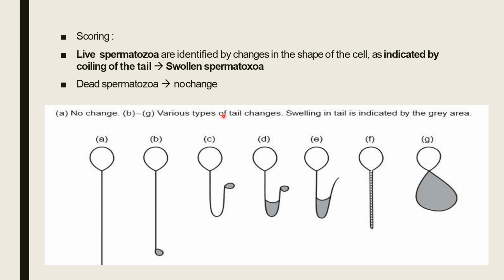So integration or disintegration of the membrane would be observed through the levels of swelling of the cells. The cells that are totally intact, their membranes are working, they would completely swell up.